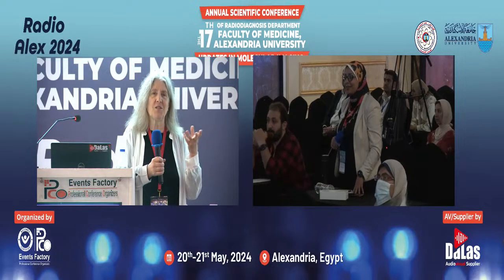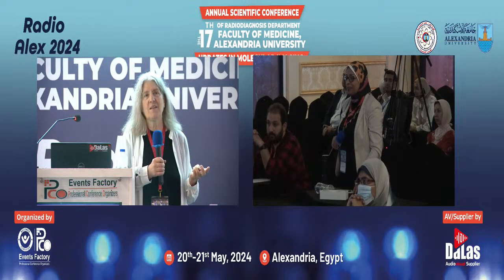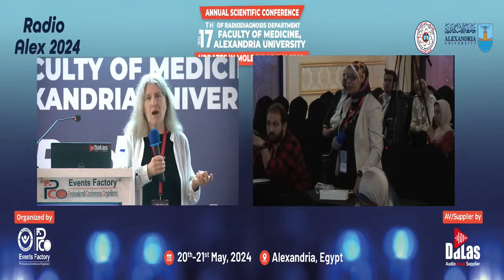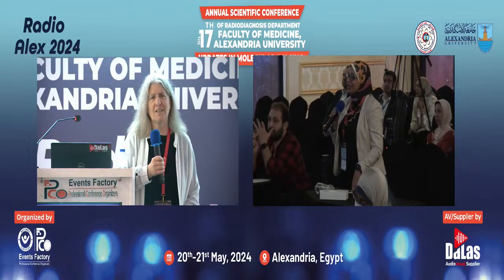If I see residual sites of tumor, it could be just fibrotic change, but in general, I think CT is probably perfectly adequate for assessing whether there's residual disease. And PET is probably not reliable because many of those patients may have mucinous tumors. That's my own feeling. Does that answer the question? Yes, thank you.